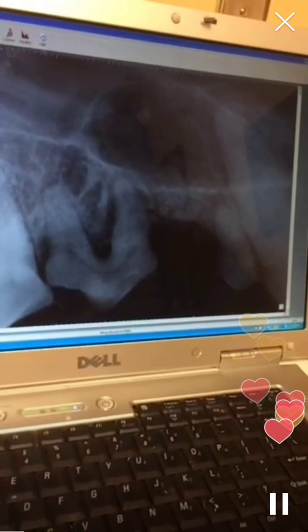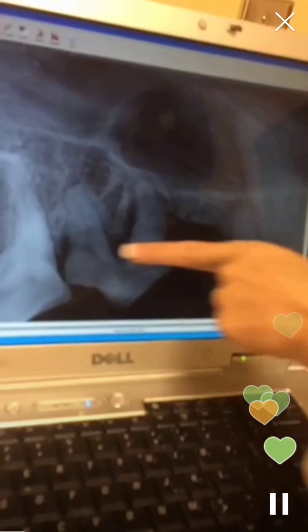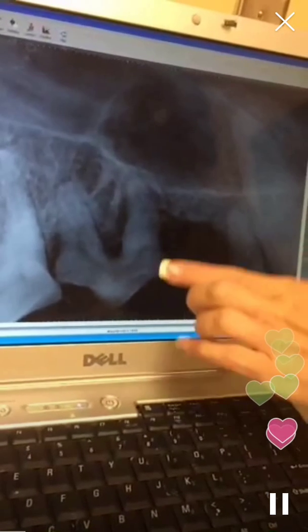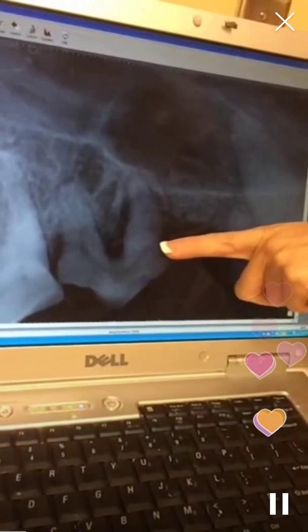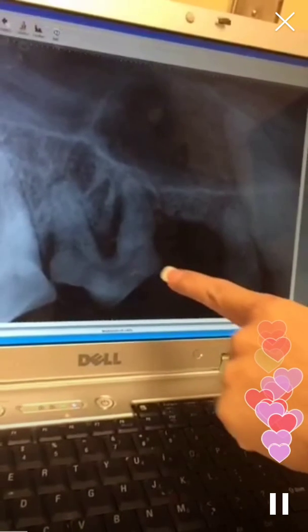Now we start to see some pathology. So this bone should be covering all the way through here. We have both vertical bone loss and horizontal bone loss. So we should have more jawbone here. But what's happened is the bacteria has eaten away at it and it's caused it to decay and rot away. This is the upper right side.